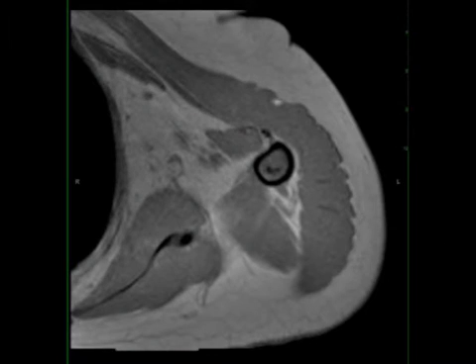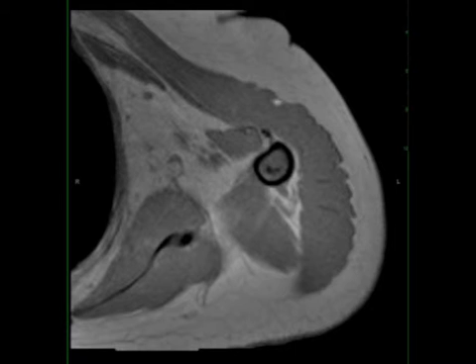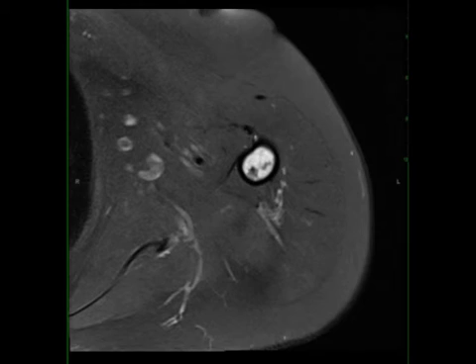Of note, there is no evidence of internal fat content on the out-of-phase images. There are nodular regions of diffusion restriction with heterogeneous enhancement. There is subtle endosteal scalloping without cortical breakthrough or associated soft tissue mass.